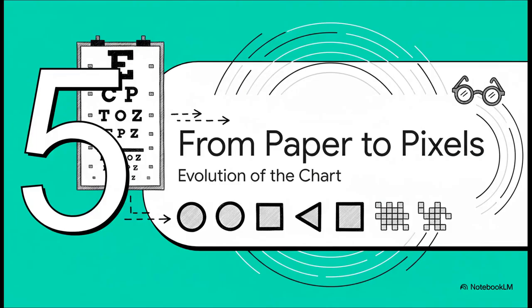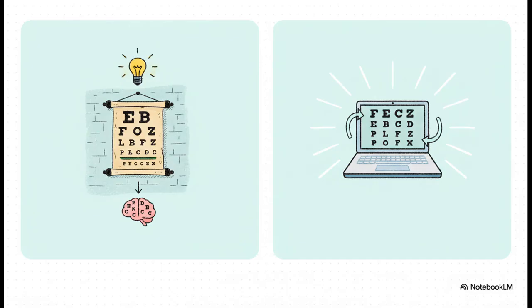All right, for our last section, let's bring it all into the present day. Let's see how this incredible 19th century invention has adapted for the 21st century clinic you'll be practicing in. Because the core principles, they're timeless, but the technology, well, that has definitely evolved. So while the core principles are exactly the same, digital technology has solved some of the biggest weaknesses of the classic chart. Inconsistent room lighting gets replaced by perfectly uniform standardized backlighting.